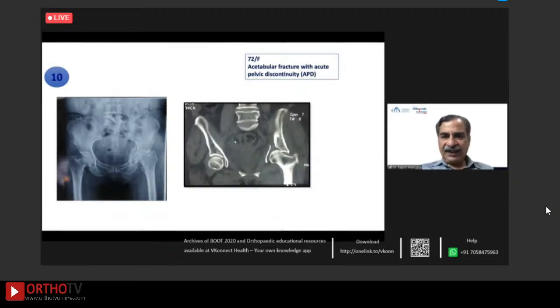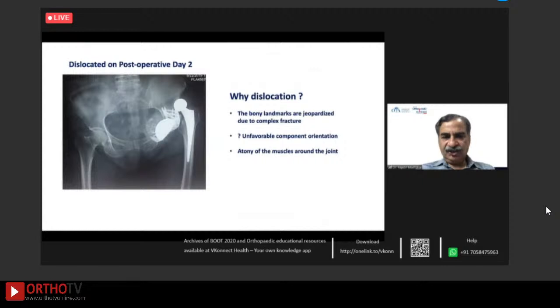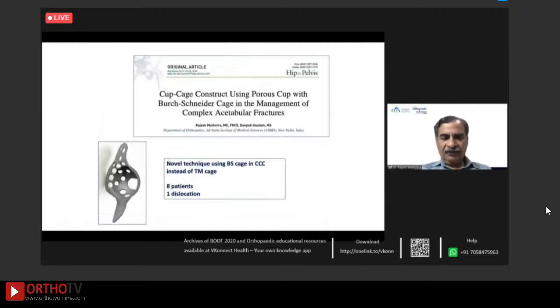72-year-old female had acetabular fracture with acute pelvic discontinuity. You can see the head was actually quite damaged, did this surgery, and it dislocated. Now, this is a very depressing scenario, but not at all rare. The bony landmarks are actually quite compromised in complex fractures. It's easy to put the components in bad orientation. And then, of course, sometimes there's an atony of muscles or the injury to the muscle neural supply. So we did closed reduction and gave a hip abduction brace. So we have published our series of cup cage construct using porous cup with Burch-Schneider cage in management of complex acetabular fractures. And in 8 patients, we had 1 dislocation.